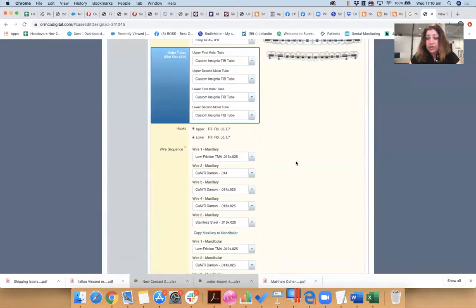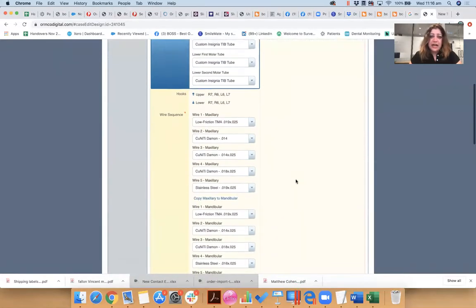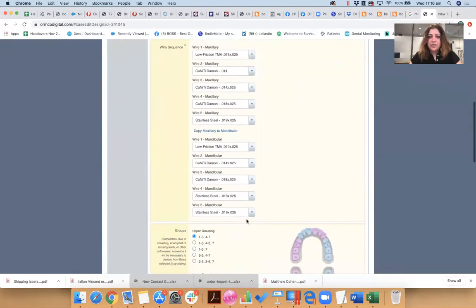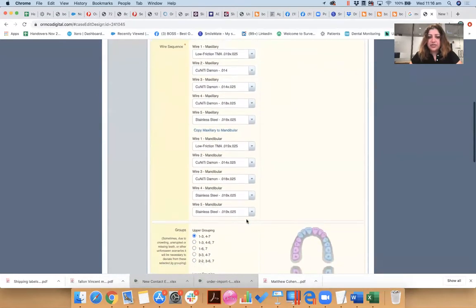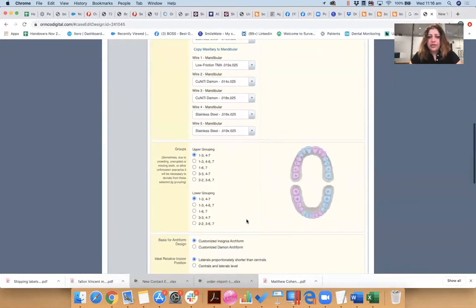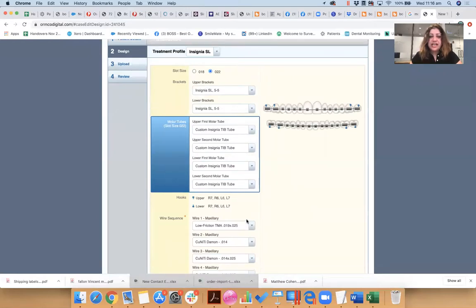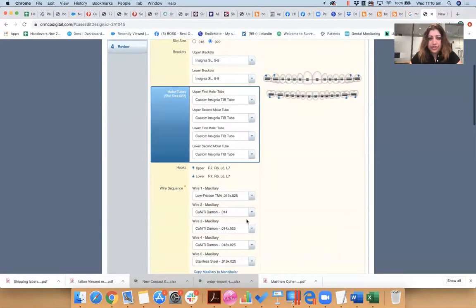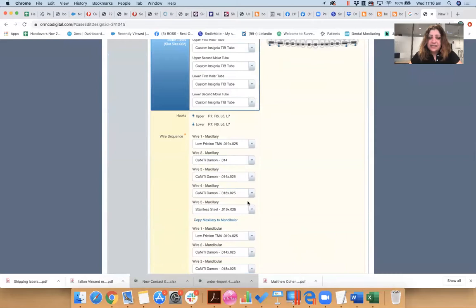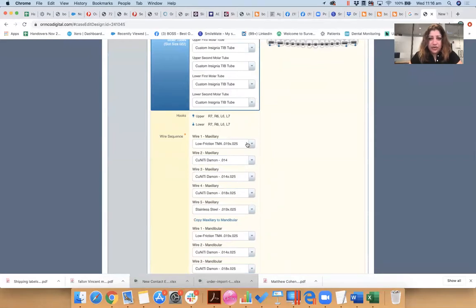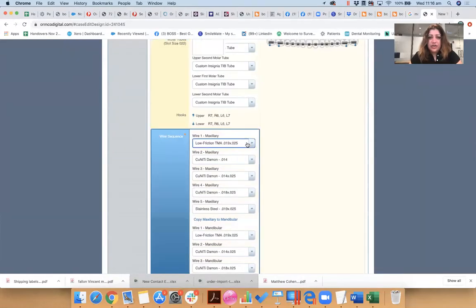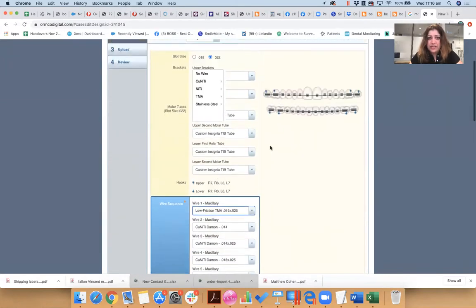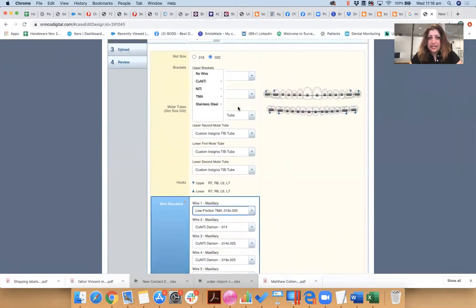So again, that means that they will give me the best fit for that tooth and in the right position according to my instructions to the technician. You can order hooks if you like, and I do like my hooks on all my molars. The wire sequence, now this is where it gets a bit tricky where you need to understand your patient's needs.